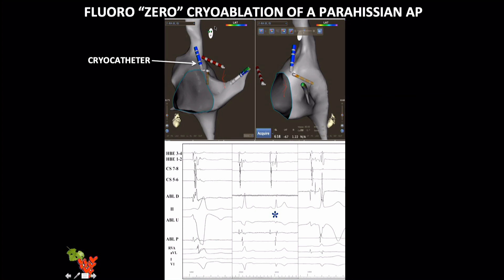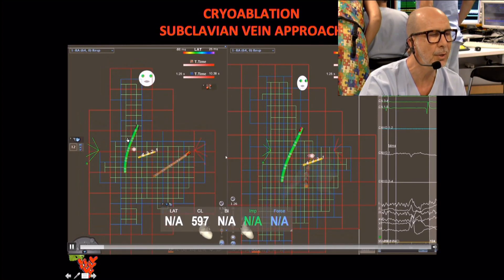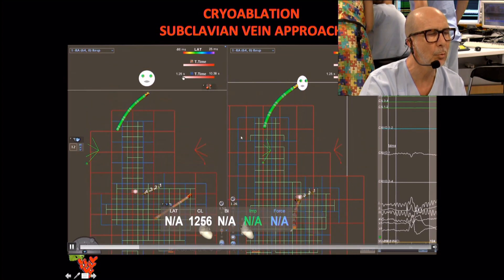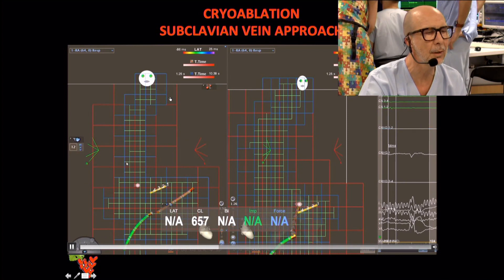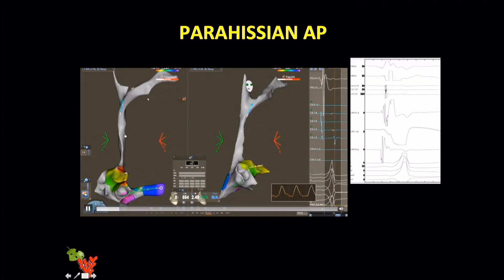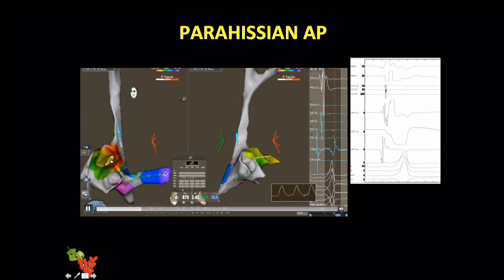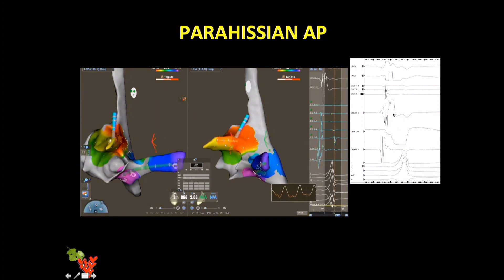In some difficult cases we can combine cryoablation of a septal accessory pathway. You can see good parameters, disappearance of pre-excitation during the cryo map, and at the end when we stop the cryo application, a large His recording from the ablation catheter. To do this you navigate the superior vena cava, then the left subclavian vein, and with the cryo catheter acting like a diagnostic catheter, navigate this venous system to reach the site of interest in the anteroseptal space, then map and achieve the result without any fluoro.